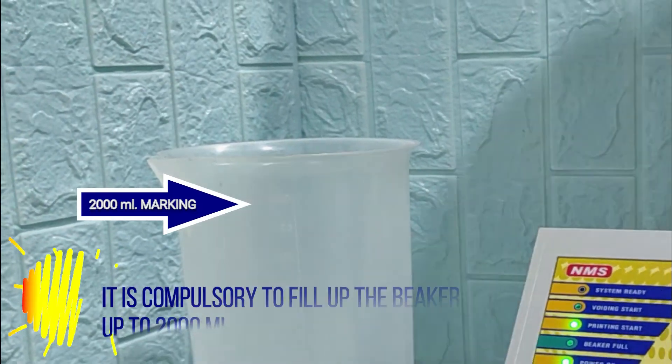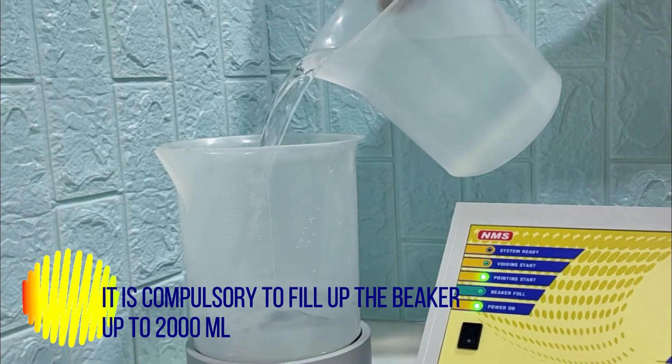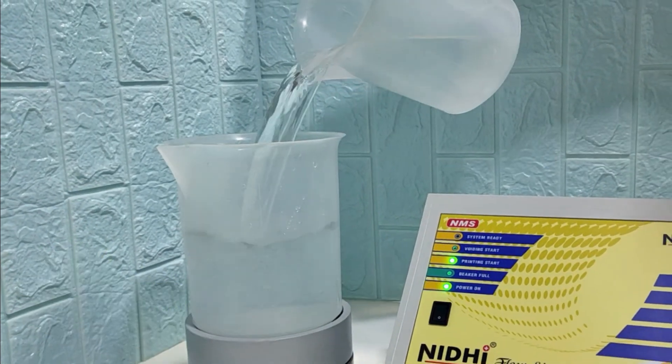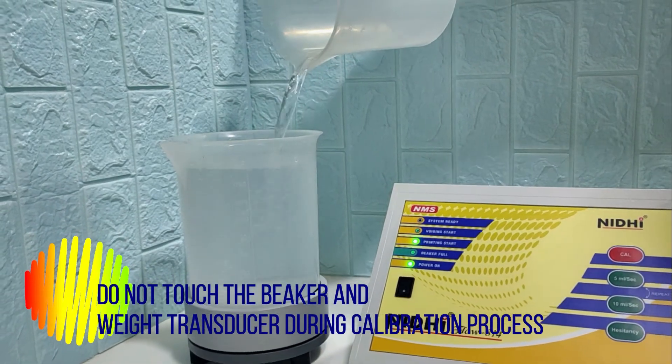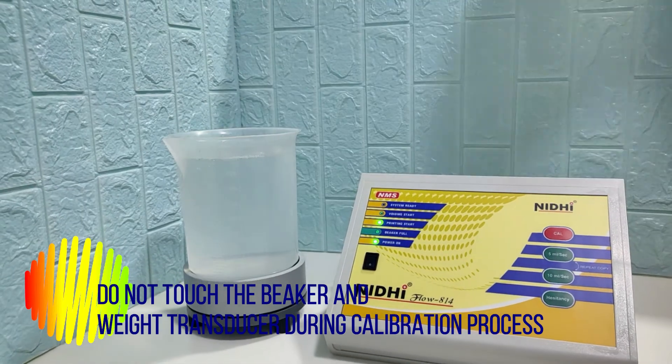Then fill up the beaker with water. Remember, for continuous accuracy it is compulsory to fill up the beaker up to 2000 ml as marked on the beaker. Please note that do not touch the beaker and weight transducer during the calibration process.